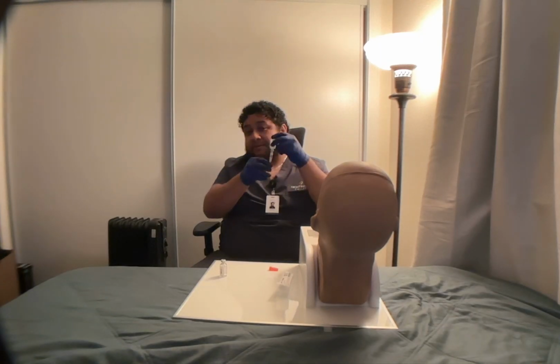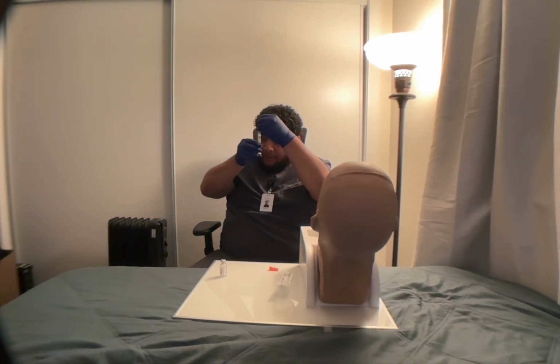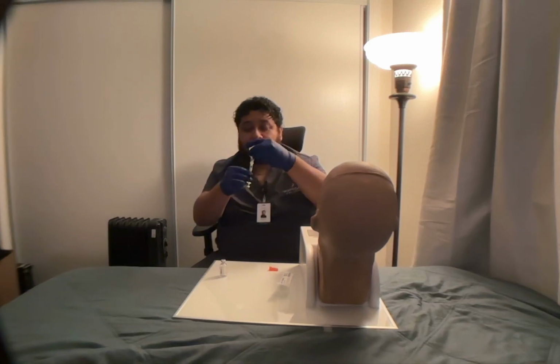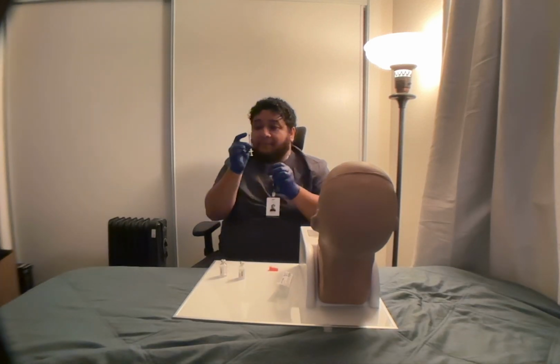I'm going to be careful not to push the plunger or overdraw. Okay, 12 units drawn. I'm going to tap to remove any air bubbles.